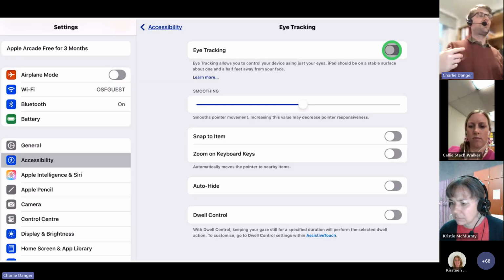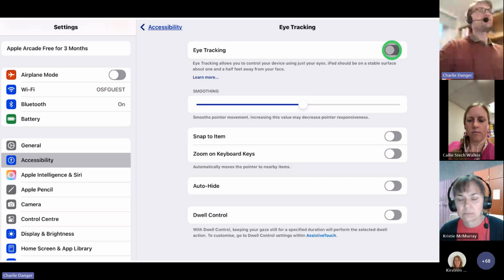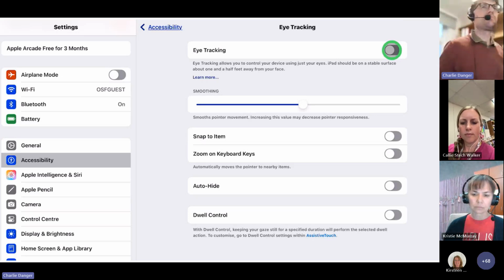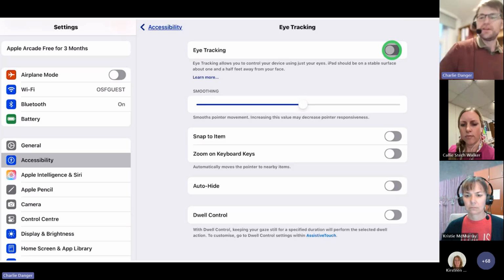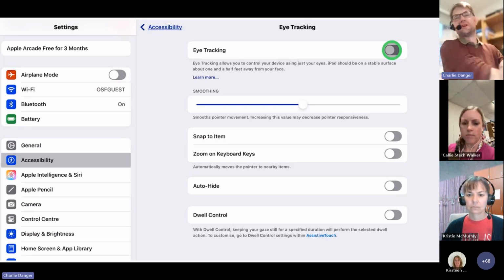So although iRespond said that places around the world could experience eye gaze, they would need some training on setting this up because it's a bit confusing how it all works. So I find it a bit confusing. But there are, luckily, websites that offer that training, such as A-Center Learning. Anyway, the next slide actually has a video of me using it, which I'm sure you've been waiting to see.